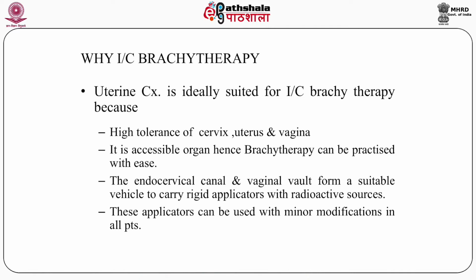In the case of CA cervix, nowadays very thin applicators are used, which can be fixed in the cavity very conveniently, and very small sources of approximately 3 mm to 6 mm are used. They can travel very conveniently in the applicators, and treatment is very convenient nowadays.